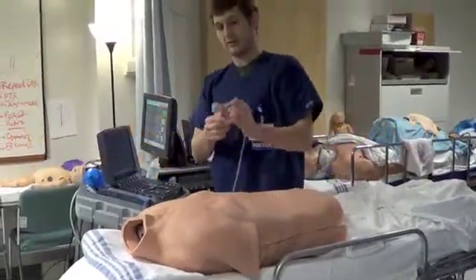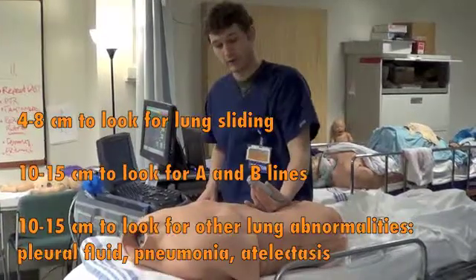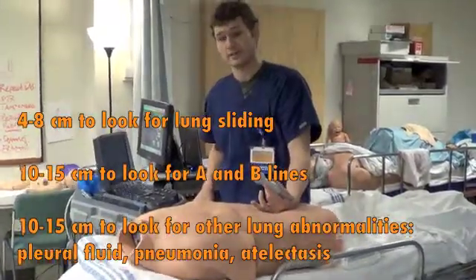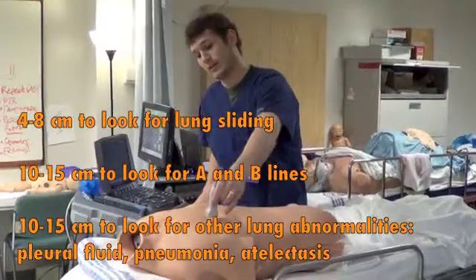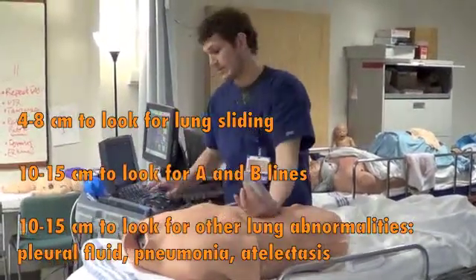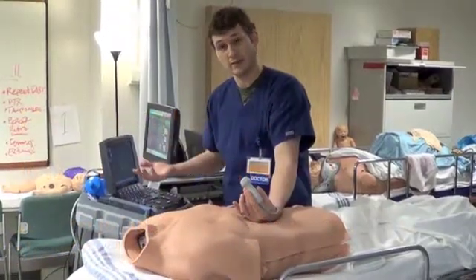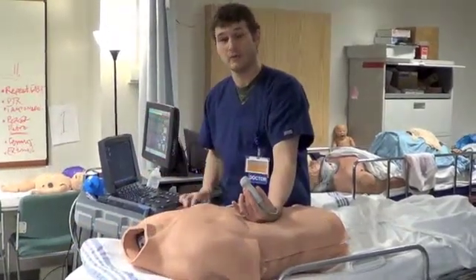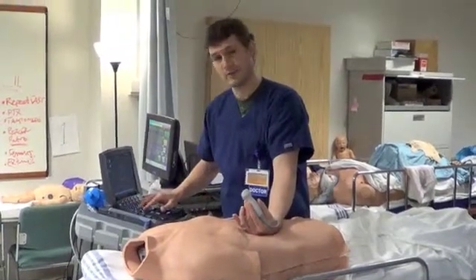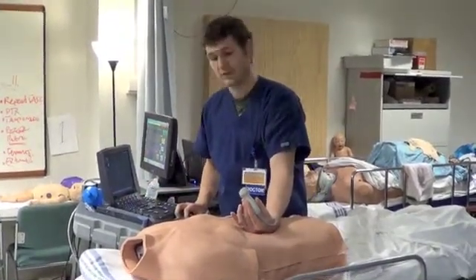Another pitfall commonly observed when doing this exam with the cardiac probe is depth. When looking at the anterior fields, you may need to adjust the depth accordingly to look for lung sliding and also the deeper structures. You can adjust the depth using the toggles on the ultrasound machine.